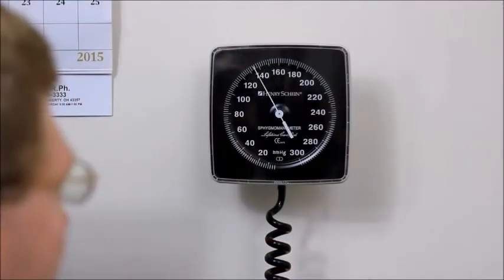You are now ready to measure the patient's blood pressure. Inflate the cuff to 20 to 30 millimeters of mercury above the pulse obliteration pressure. Then deflate the cuff at a rate of approximately 2 millimeters of mercury per second, while listening with the stethoscope for Korotkoff sounds.